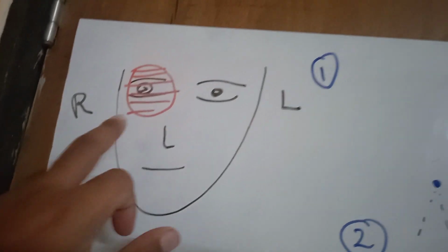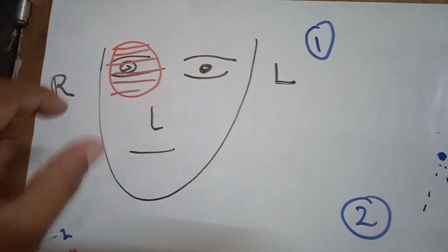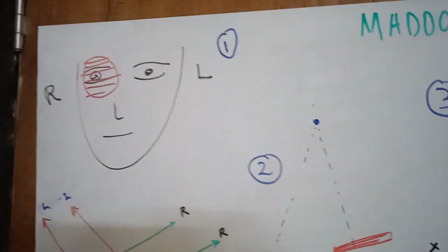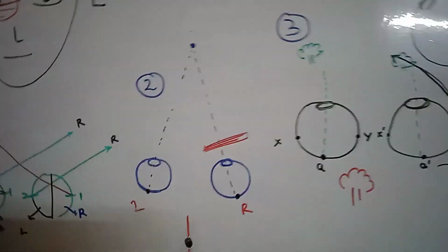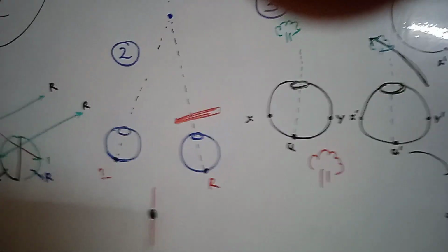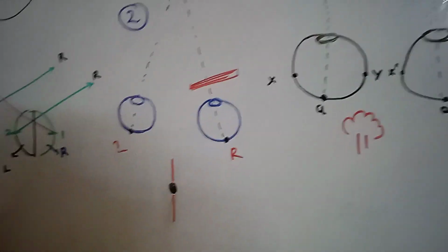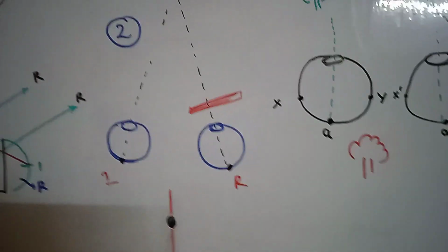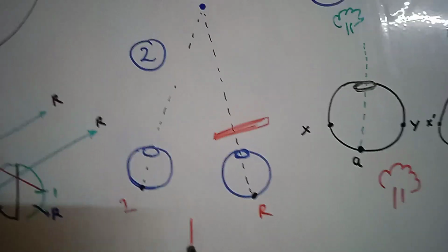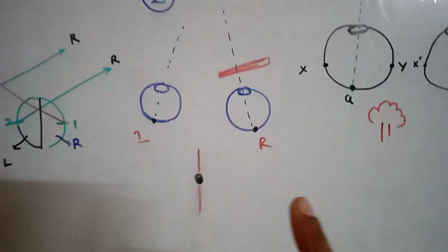First things first, you see right eye, we have the red color rod cylinder on the right eye. It is always present on the right eye. You will see a lot of images on Google and other places where the rod will be placed on the left eye sometimes and right eye, but no, it is not a choice that we can place it wherever we want. Of course we can draw conclusions still, but by rule we place the rod on the right eye. That means your right eye will see a red color beam and your left eye will see a dot.